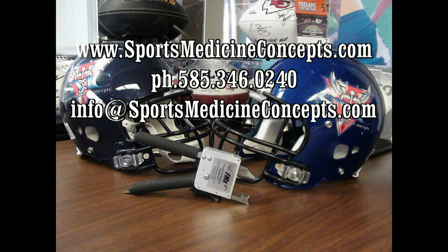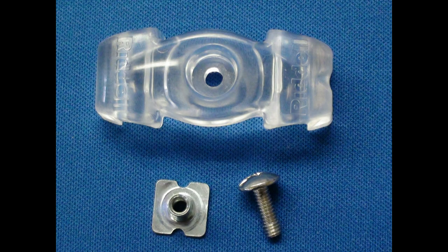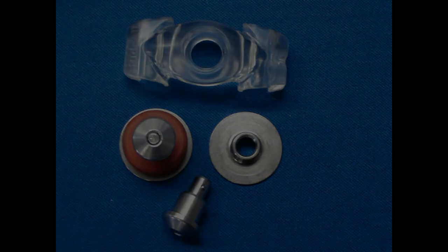Welcome to Sports Medicine Concepts educational series addressing using the FM extractor to cut various football face mask fasteners. In this segment we'll be reviewing face mask removal from the Revolution Series football helmet outfitted with the bowtie fasteners, including both the fixed screw bowtie and the quick release bowtie fasteners.